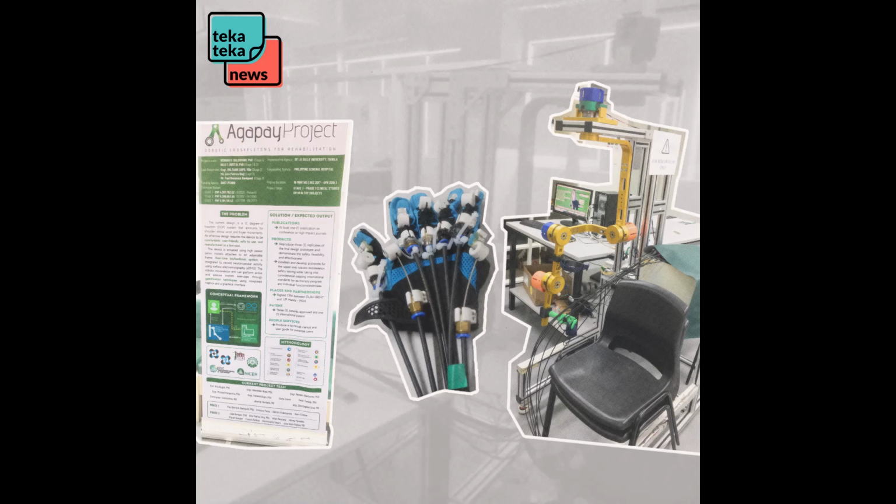The way that things go now, one PT is typically assigned to one patient. And that exercise can be as long as 1 hour and as short as 30 minutes. So they have to have a lot of staff, a lot of rooms. What if you have a machine that can help direct positioning, can help do the exercises or do an assistive for the exercises? It could be a multiplying factor. That's Volter Dupo. He's an engineer and the lead researcher of the DLSU Institute of Biomedical Engineering and Health Technology's Agapay project.